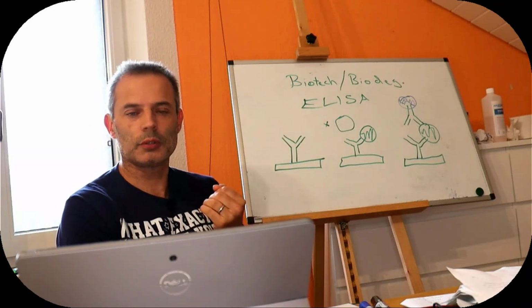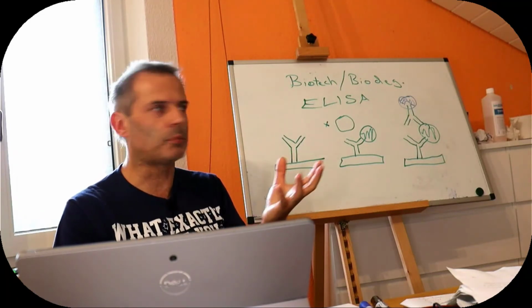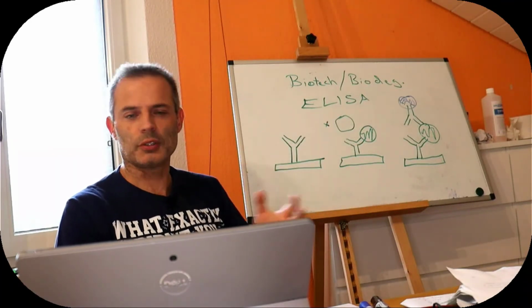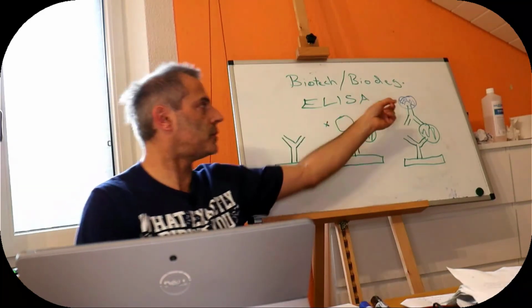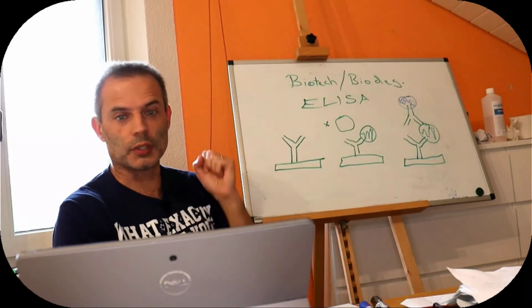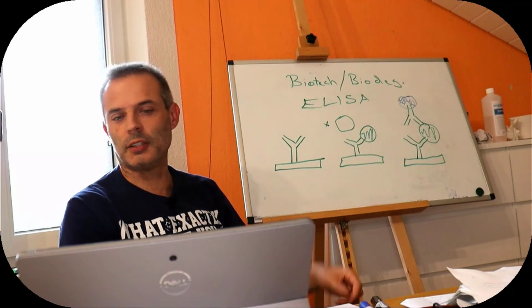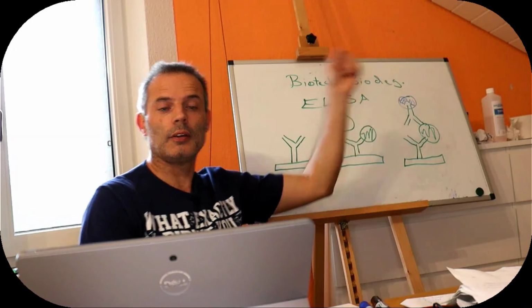In that case it's important because we will get a number. The typical numbers in that case go from 1 to 5 from an older test. It's actually called RAST, from a radioactive detection method, but it's not done like that anymore. Radioactive tracers are very efficient, so if this had a radioactive tracer on it, we could measure it with a piece of old style photographic film really easily. You just lay it on top, leave it for some time and have a look. If it doesn't detect, then you get another piece and leave it on there for longer, so we have the same advantage that we had with the enzyme.